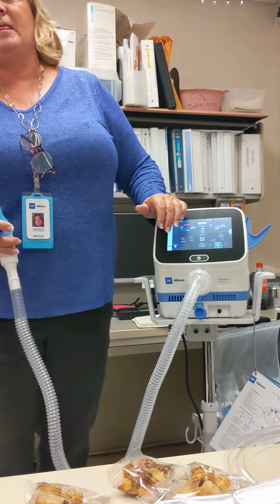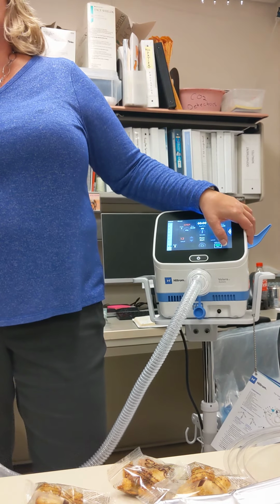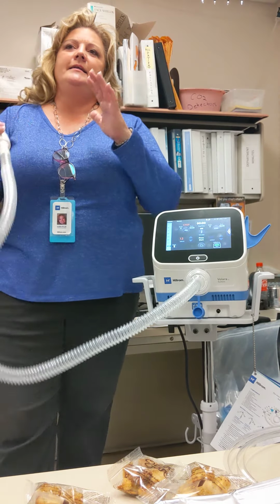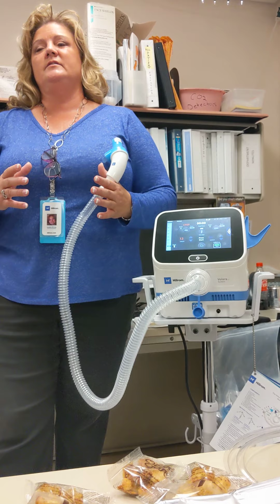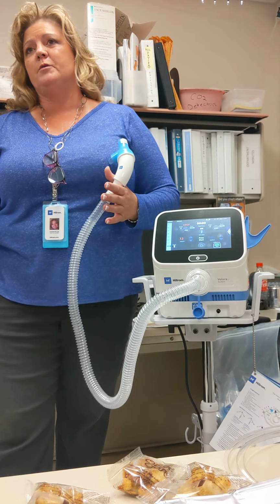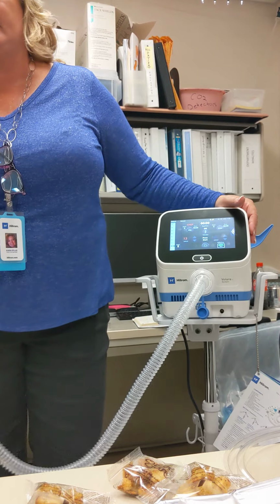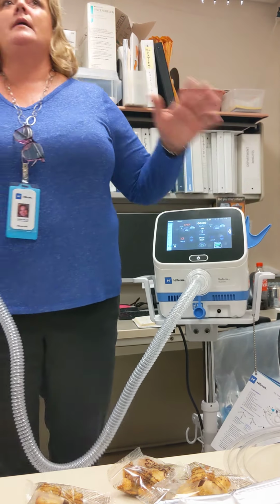Do you also keep it in medium frequency? It all depends. The frequencies, we're doing studies on that now. It is just a tool in your toolbox. A lot of times it's comfort for a spontaneous breather, and sometimes RTs are staying there for 10 minutes and they get bored, so they switch back and forth. Does it help?